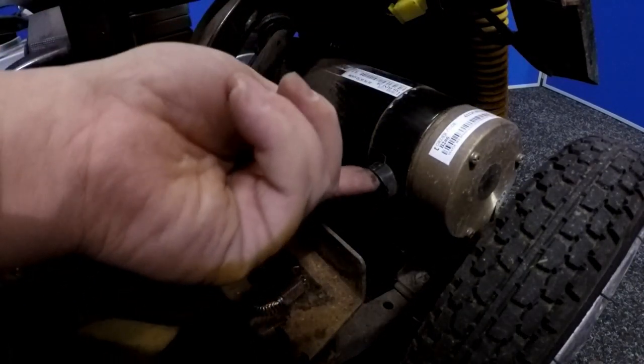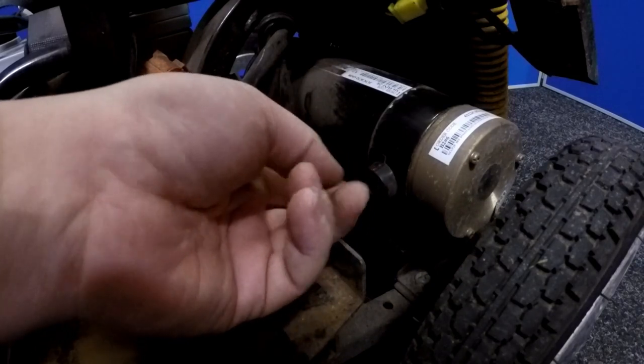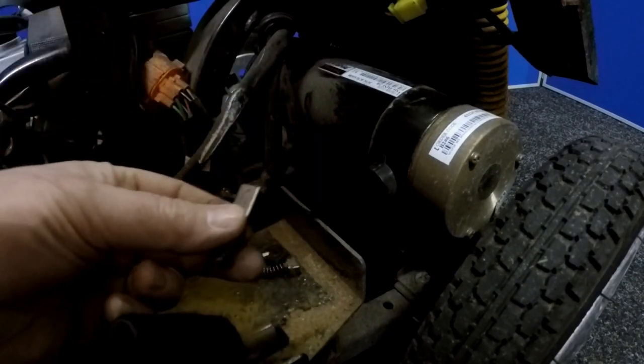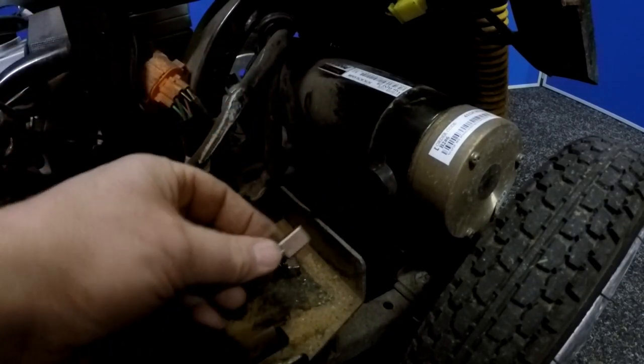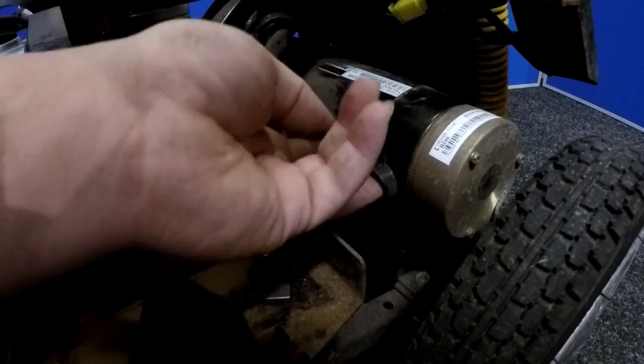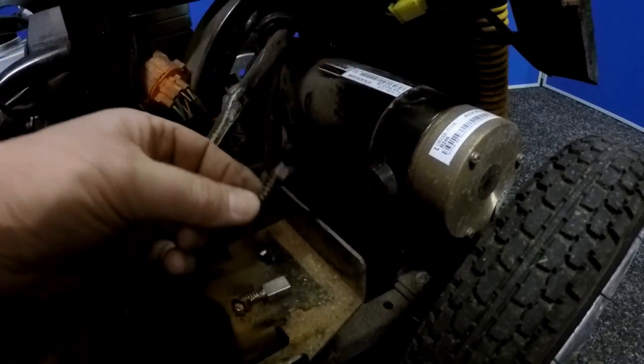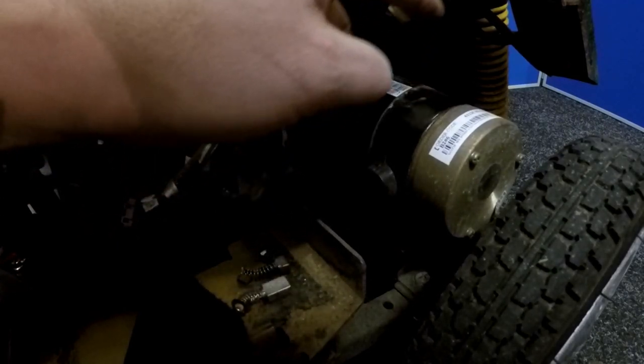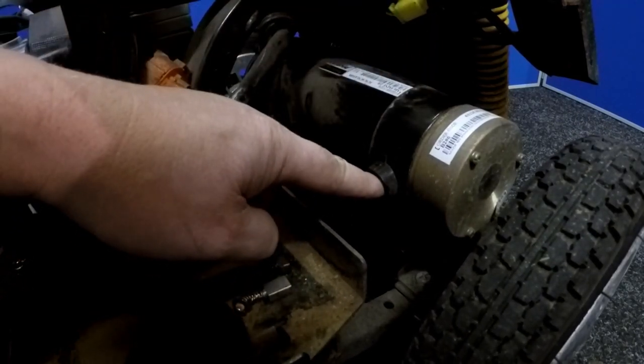We'll also look inside the motor to have a look at the colour of the commutator. The commutator is the bit inside the motor that the brush unit goes against — that should be kind of golden in colour, it shouldn't be black, which I presume this one will be. If that is the case, what we need to do is strip the motor and clean the commutator inside there.